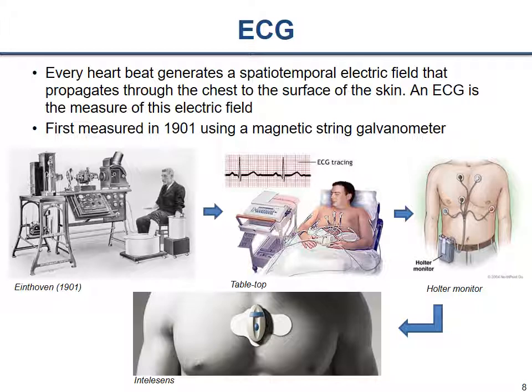This is where things like a Holter monitor come in, invented by Dr. Holter, who interestingly has UCSD affiliations, which is basically a portable version of the tabletop device. The original forms recorded ECG continuously for some set amount of time, and then you would have some elaborate connection to your phone, and you would dial the results back to the hospital so that they could look at it. Of course, now we can just connect to the internet and download them directly.